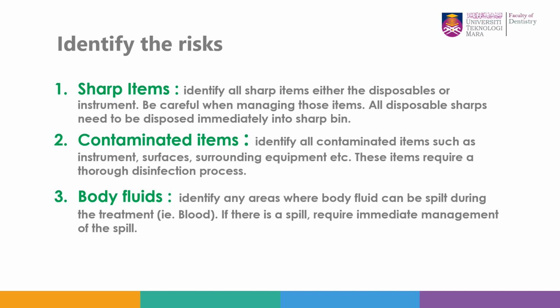So as for sharp items, you need to identify all sharp items, either disposable or instrument itself. Be careful when you are managing those items, not to prick yourself with these sharp instruments. And those disposable ones, you need to dispose of the sharps into the sharp bin available in your clinic. For the contaminated items, for example, the instrument surfaces or surrounding equipment, you need to thoroughly disinfect these surfaces after the patient has left your clinic or operatory room.